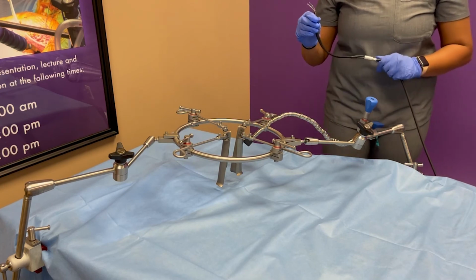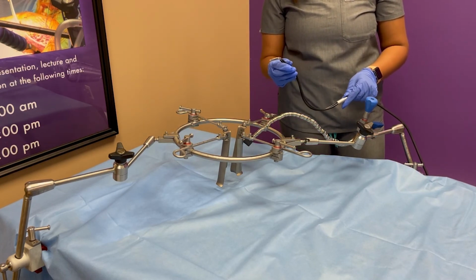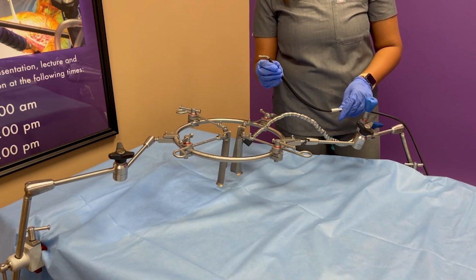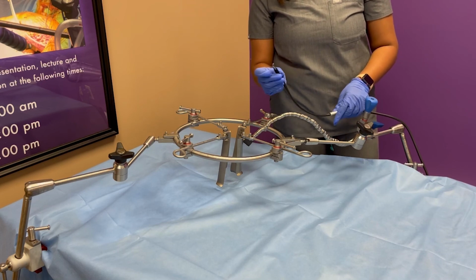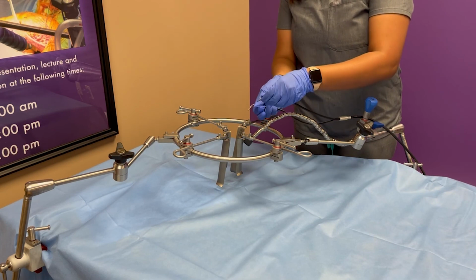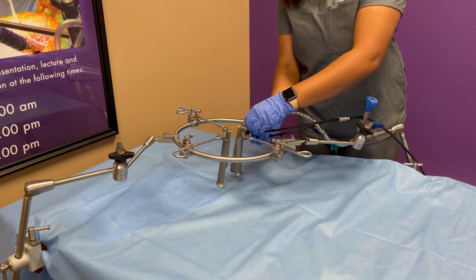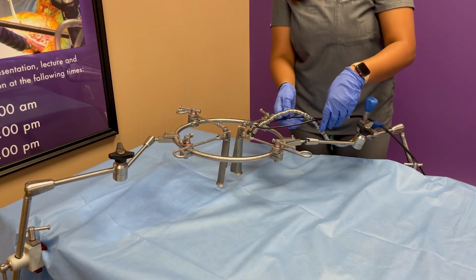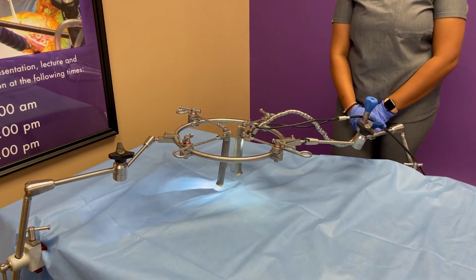The final step will be to insert the TSI light cable into the flex arm. You should already have the light cable attached to the light source and plugged in, and be sure to check and make sure that there's adequate light. So you will take the two pronged ends of the light cable and insert it into the two holes at the distal end of the flex arm. You can then turn on the light source, and that is it.